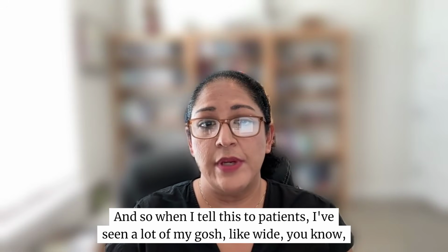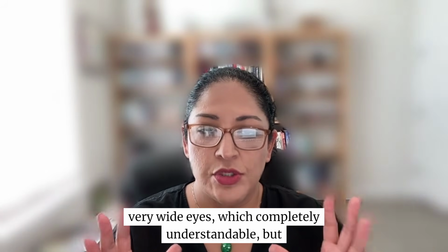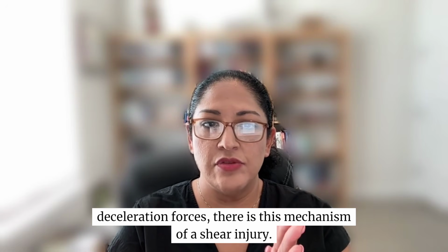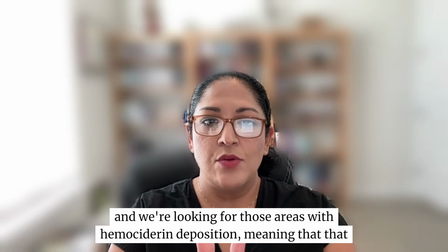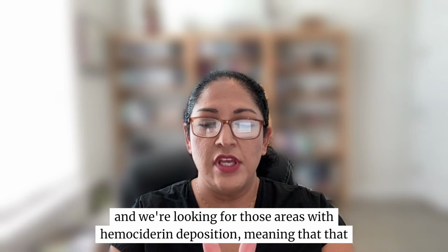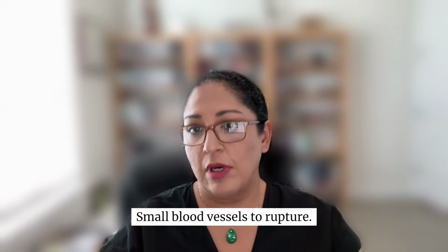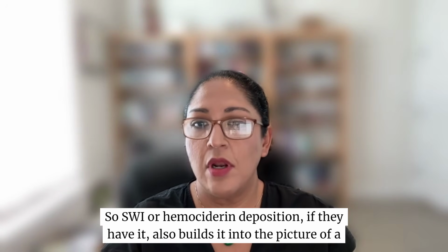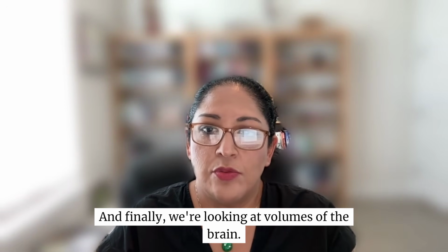And when I tell this to patients, I've seen a lot of, oh my gosh, very wide eyes, which is completely understandable. But I basically tell them, when you're in a car accident and there's this acceleration, deceleration forces, there is this mechanism of a shear injury. And we're looking for those areas with hemosiderin deposition, meaning that shear injury was strong enough to cause small blood vessels to rupture. So SWI, or hemosiderin deposition, if they have it, also builds into the picture of a concussion.